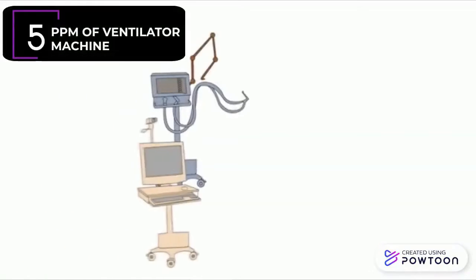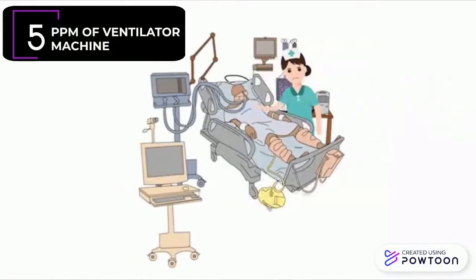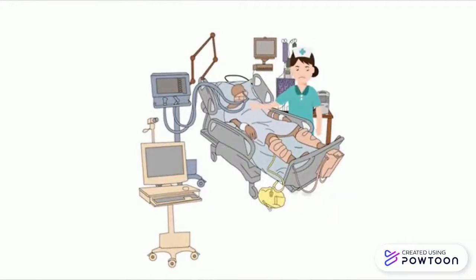A mechanical ventilator is a very complex device, which is used to ventilate patients suffering from chronic lung diseases or after a complex operation, to keep them alive, strong, and healthy. A patient with severe lung disease needs a ventilator for life support.